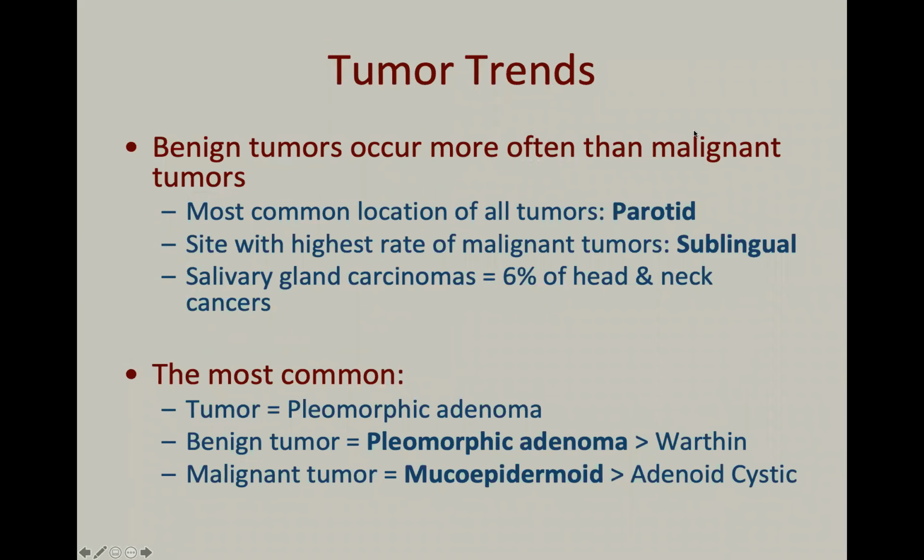So that was basically the non-neoplastic entities. Does anybody have any questions or comments on the non-neoplastic entities before we move to the tumors?